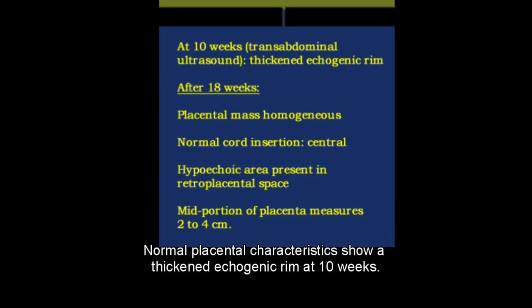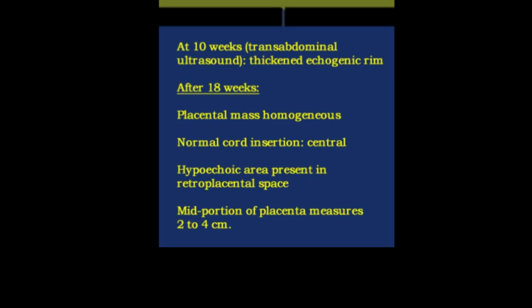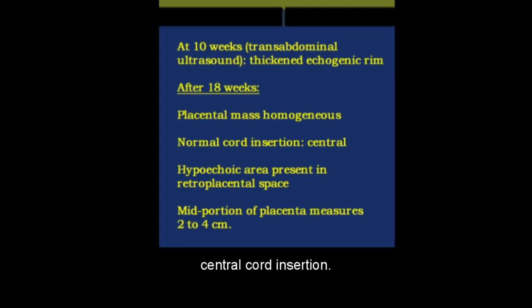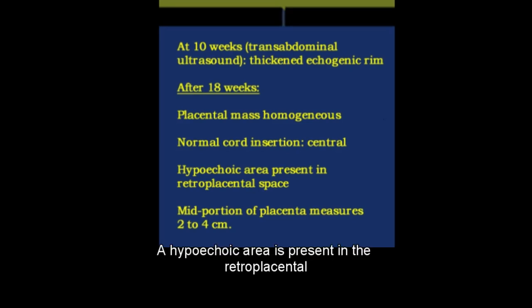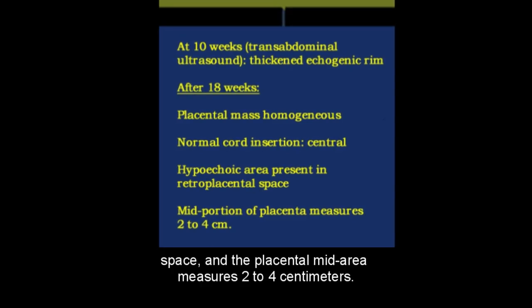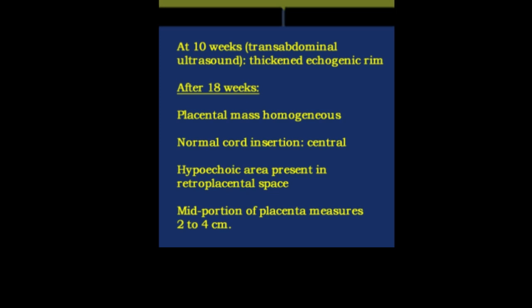Normal placental characteristics show a thickened echogenic rim at 10 weeks gestation. After 18 weeks, there is a homogeneous placental mass and normal central cord insertion. A hypoechoic area is present in the retroplacental space, and the placental mid-area measures 2 to 4 centimeters.